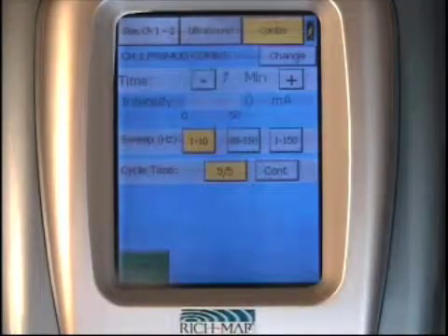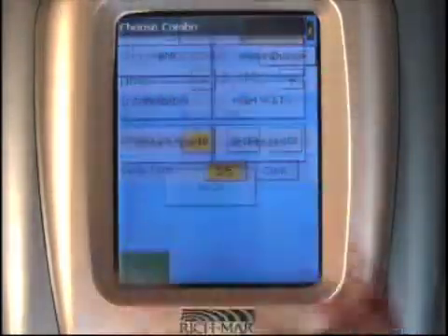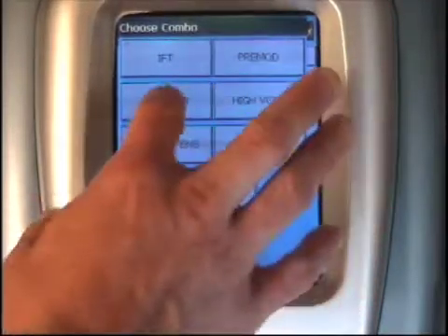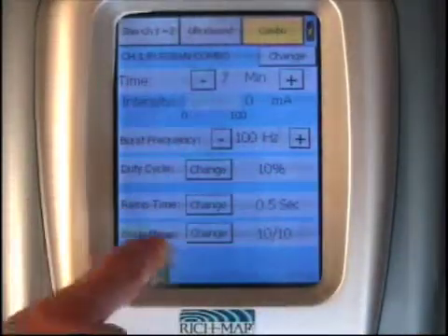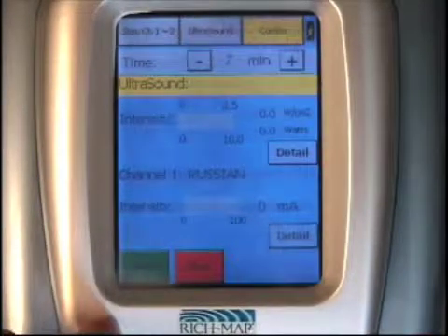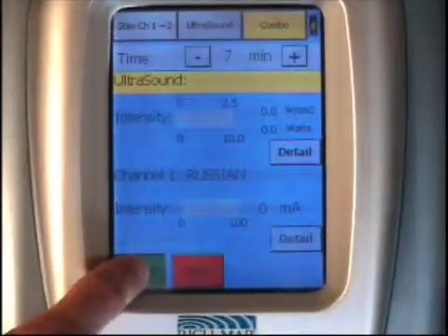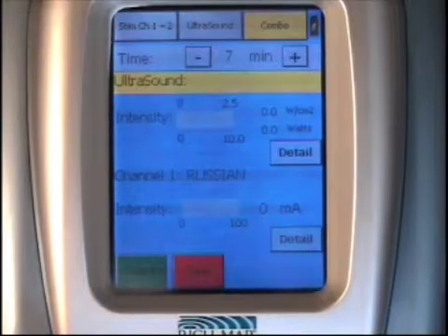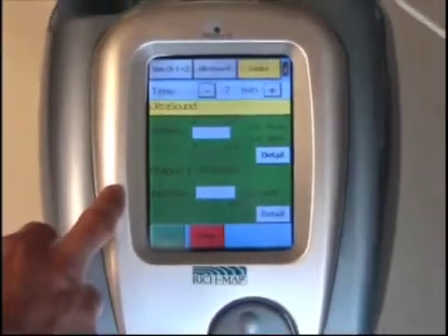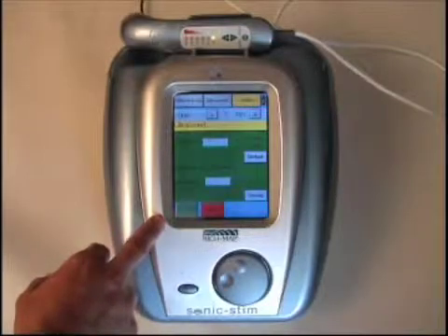You then select the blue background within the stem side of the combo and press the detail button. At that point, you have the ability to choose your modality. Once you choose the modality you want to operate, you simply set the parameters just as you did in the stem and hit OK. Combo mode is then ready to go. You hit the start button and the screen turns green, with the ultrasound live as indicated by the illuminated light on the applicator.